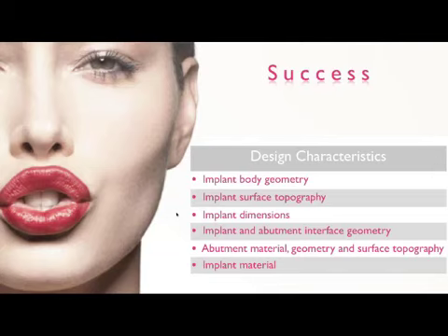The abutment material, again, we've seen the phase changing from gold to titanium to alumina oxides and now to zirconia oxides. These abutment materials are important in terms of soft tissue health and the final aesthetics of our cases as well in situations where we have thinner tissue. And finally, we had implant material. And the implant material that Yorkstadt was talking about was comparing different grades of titanium, grade 1, grade 2, most common now grade 4. Each one has different physical properties and allows us to have better success, less mechanical failures.